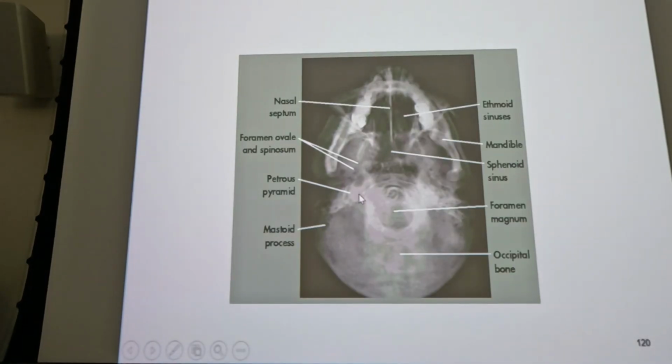What we're going to see this on then is sinuses. We're going to see it for the sphenoid sinus. We're going to see it done tabletop for the zygomatic arches, for cheekbones and facial bones. So we're going to see this one over and over again as well.